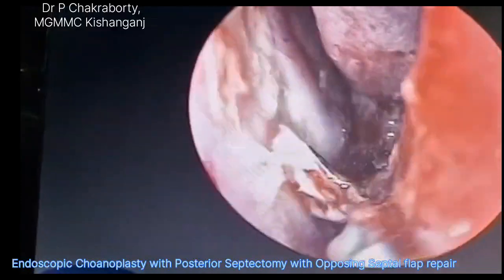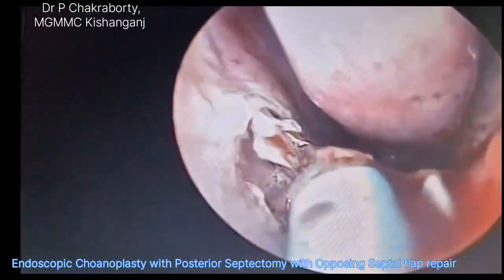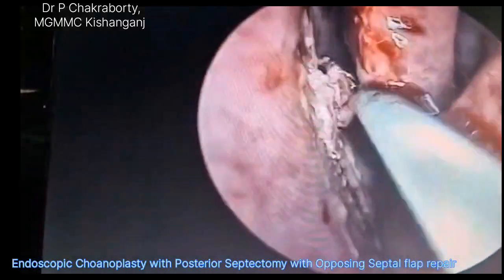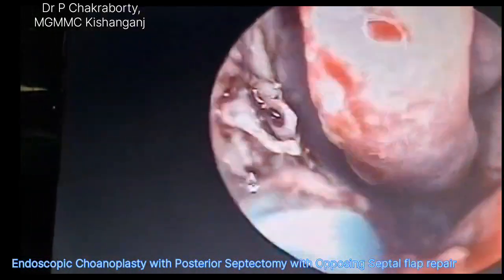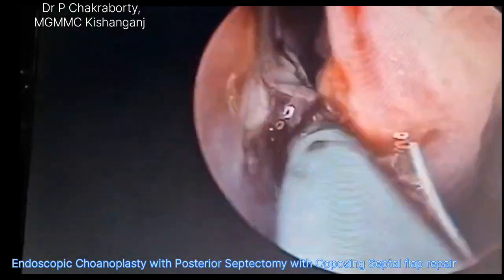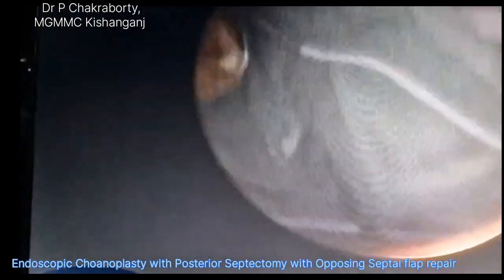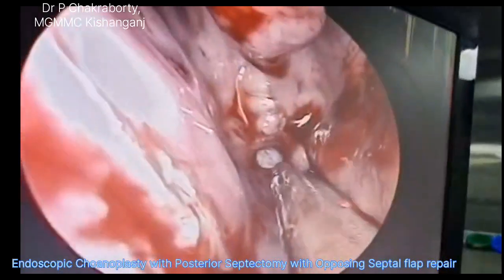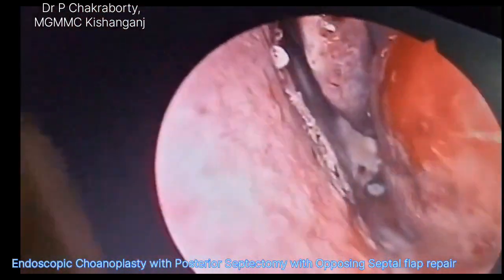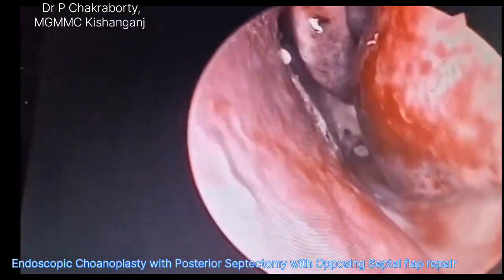So we are taking the incision first on the left side, and as you can see we are taking inferior to superior direction. This flap will be based on the supply from the inferior aspect, and the opposite side of the septum a flap will be raised which will be superiorly based. So we proceed on to raise the flap on this side.